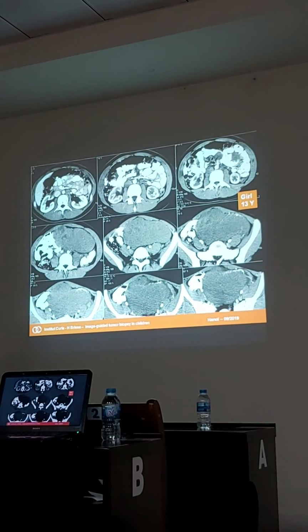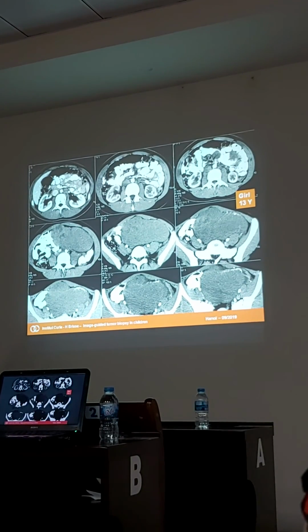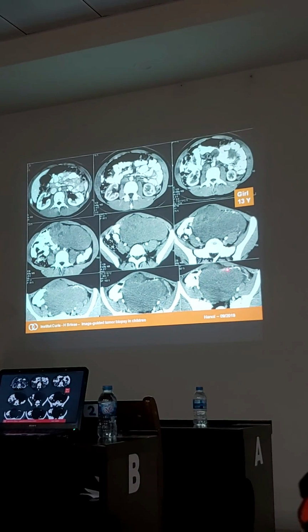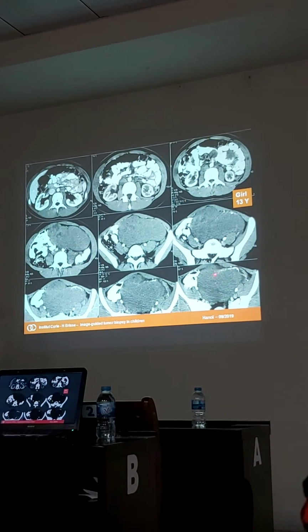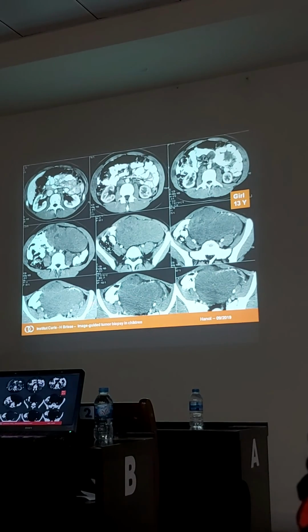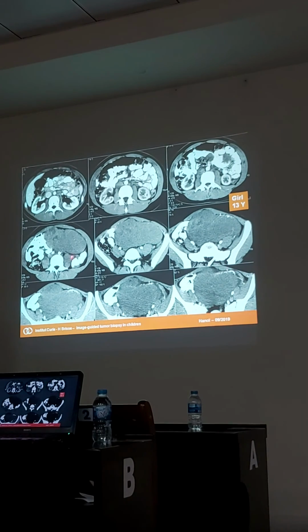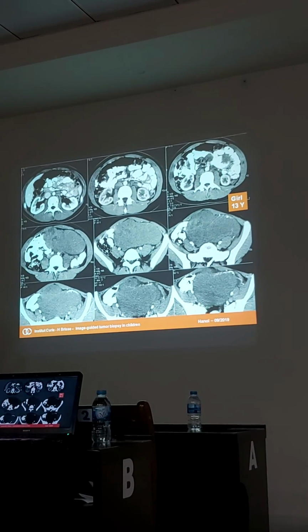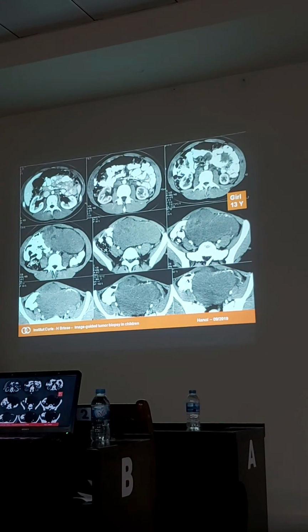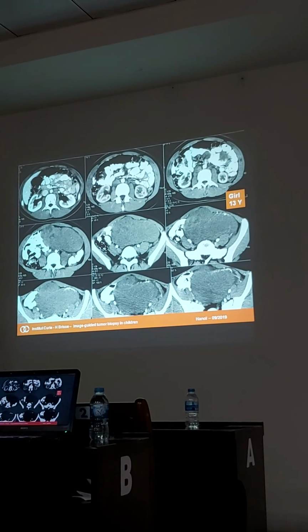And as you are a good radiologist, you also know how to confirm this. You can see here, at the periphery of the mass, there are some vessels going into the mass. So follow the vessels. Here, here, here, here, here. So this is the exact location of the gonadal vessels. Okay. So you know it's a gonadal vessel. It's a gonadal tumor, a left one.